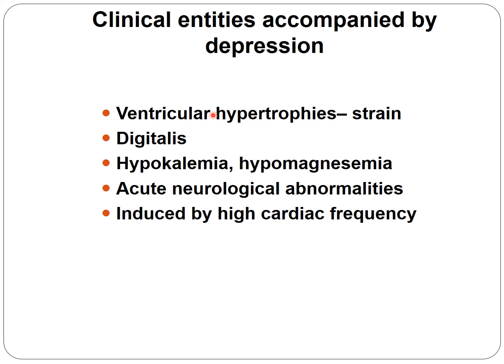Clinical entities accompanied by ST depression: ventricular hypertrophy such as strain, digitalis, hypokalemia, hypomagnesemia, acute neurological abnormalities, and high cardiac frequencies.